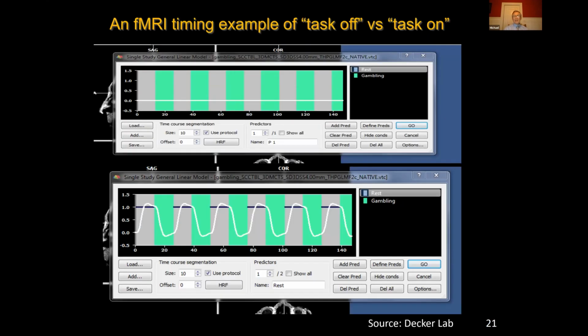This is what the timing of these fMRI images look like. At the top, you'll see essentially data collection while the brain is resting. So you see these green boxes. This is where we're going to challenge the person to record data. Right now, that white horizontal line just represents a general lack of activity. The image directly below that, the sinusoidal wave, shows the challenge that's being given, and the green bars are those time points that we're seeing an increase in oxygenated blood flow into the brain.